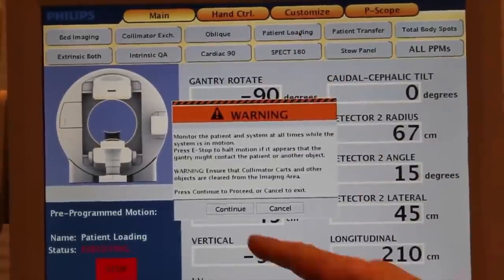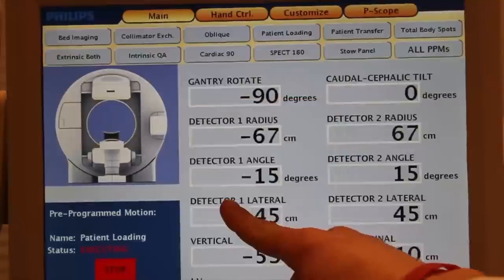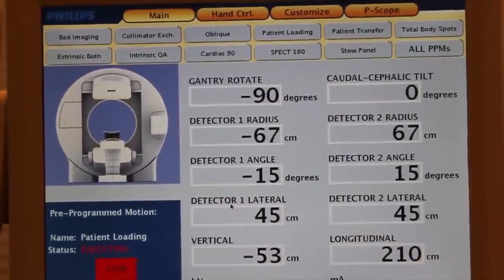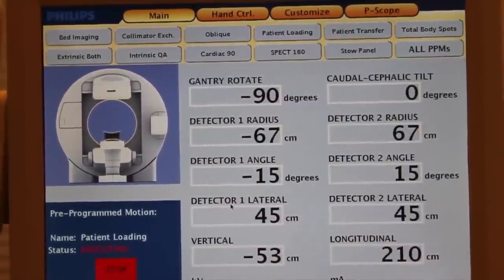Now we are ready to prepare for the daily workflow by initiating patient loading preprogrammed motion.